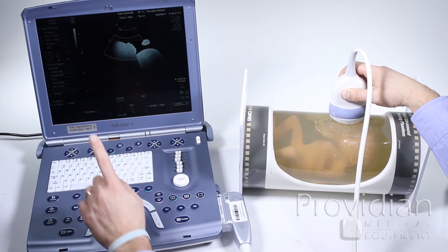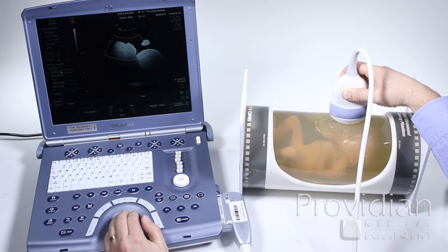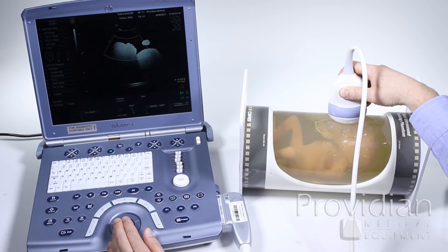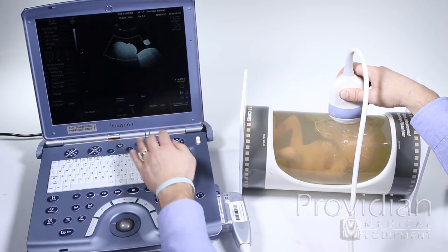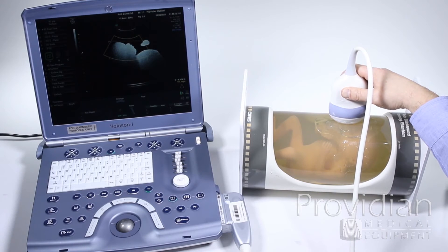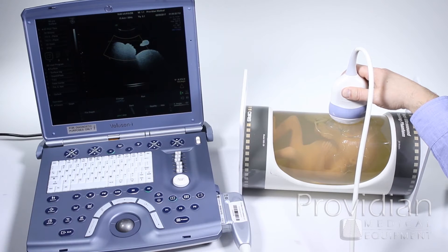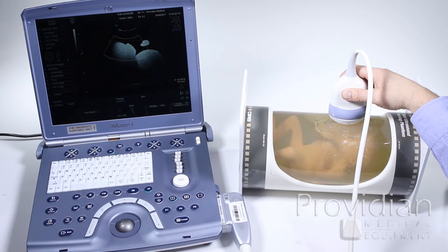Over on the left-hand side you will see some presets: Surface, Surface Big, and a custom preset. I'm going to choose Surface — this is what's default on your system. If it came from Providian, chances are we did a custom preset for you; if not, you can call us and we'll help set one. First thing I want to do with Surface is change the quality to max. That's going to slow down the frame rate a little bit, but it's best to trade frame rate for quality — it uses more lines to get that surface, so it's a much more detailed image.